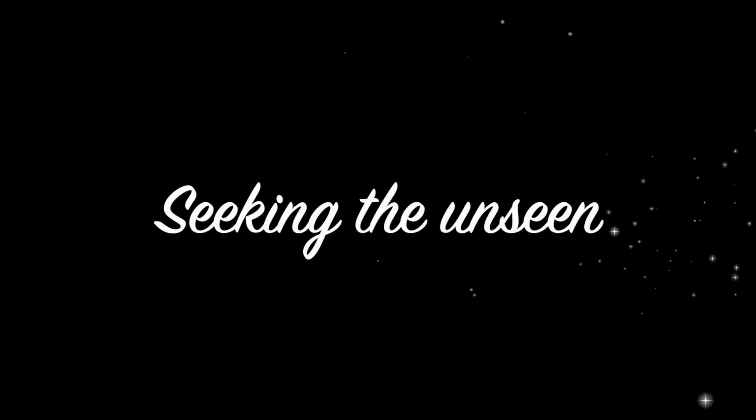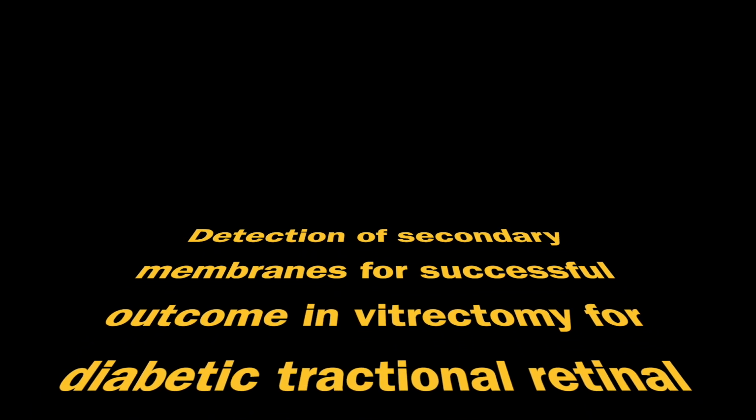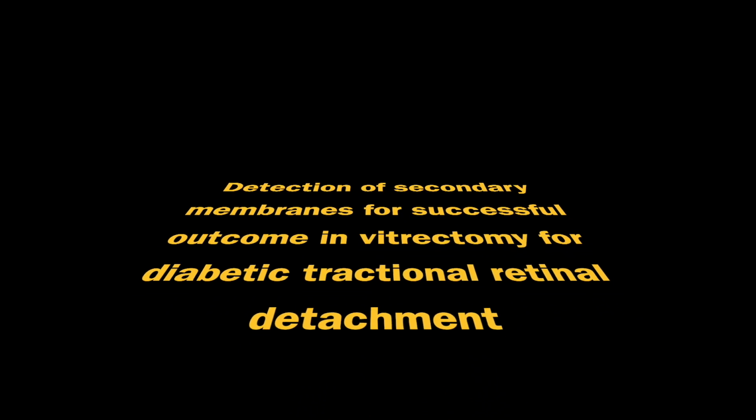Seeking the unseen. Detection of secondary membranes for successful outcome in vitrectomy for diabetic tractional retinal detachment.